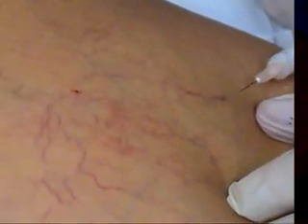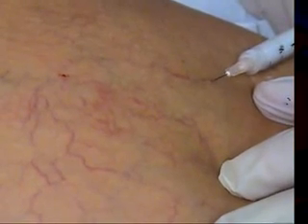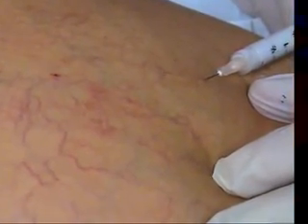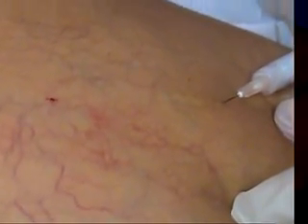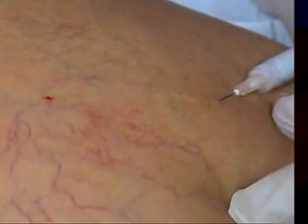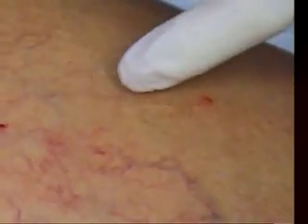Okay, I'll take another one, please. You always want to try and inject uphill. Here we go again. One needle coming in. See that? Just that foam gradually working its way up here. Now this foam is under a lot more pressure than if we were just injecting 0.1% sotradecol. It doesn't want to go too far here, but if you look at that white area, you see it staying white for a lot longer than if you just put in the regular sclerosing agent.